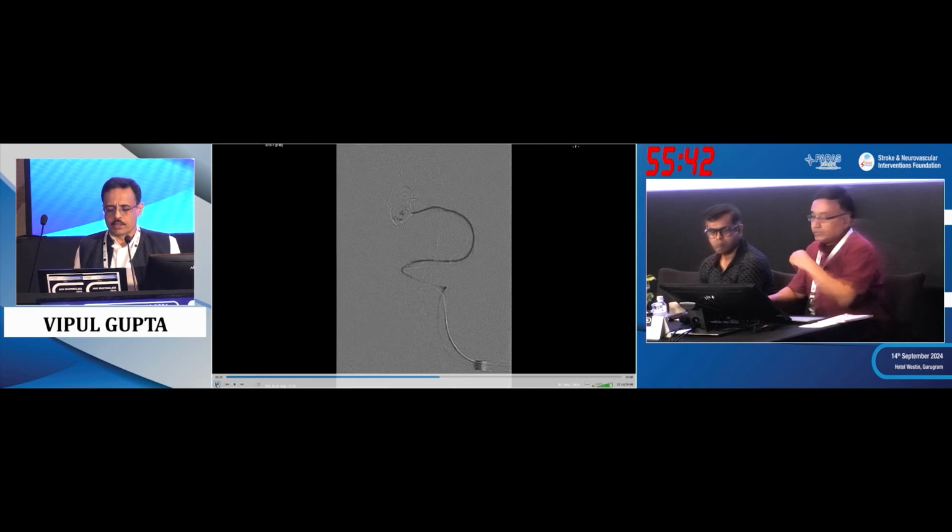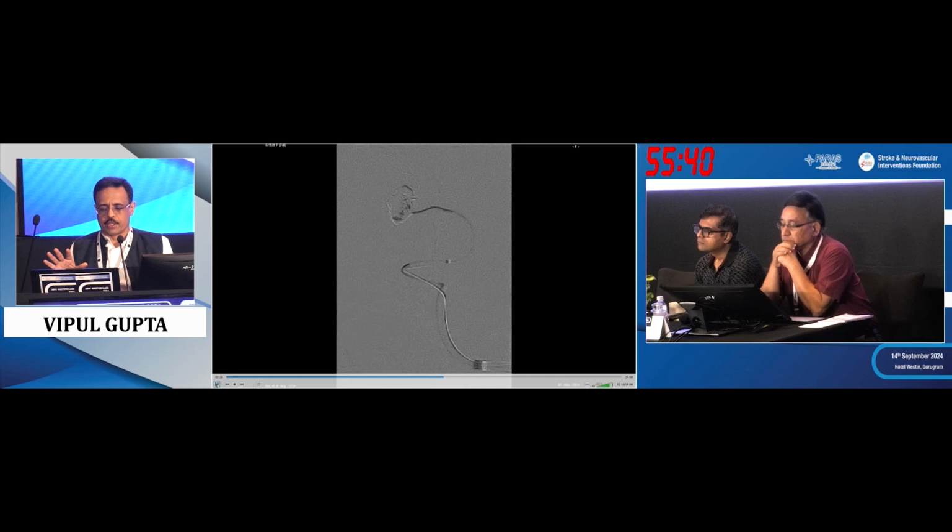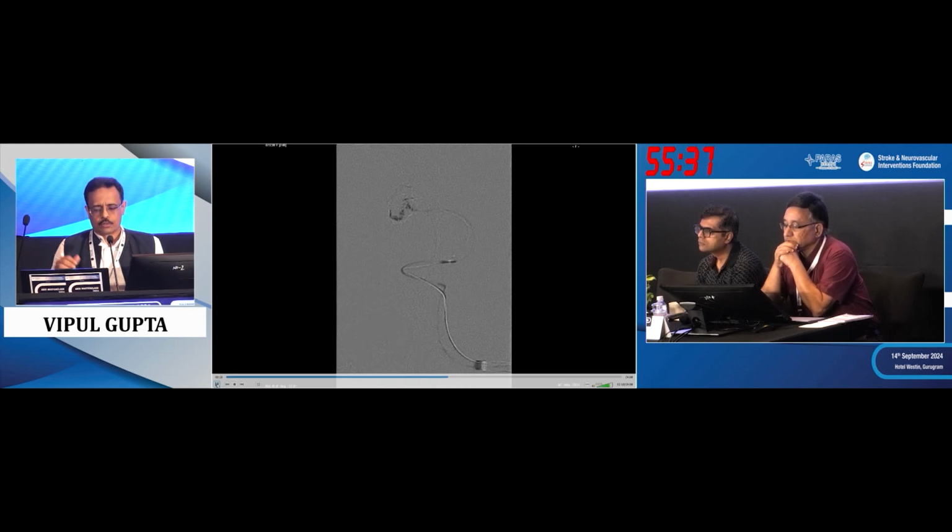So we try to coil. As there's some coil coming there, overlapping the stent, doesn't matter. That is where the stent is open. So we have re-entered the lower part now. So this is what we do with the stent.